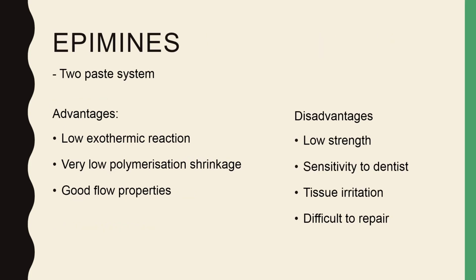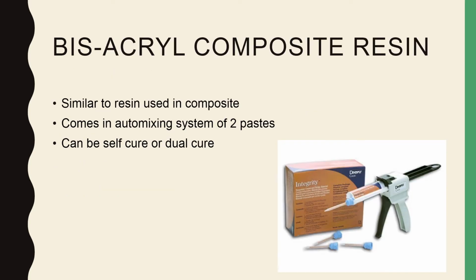The epimines are supplied in a two-paste system. They have the advantages of having low exothermic reaction, very low polymerization shrinkage, and good flow properties. While the disadvantages are having low strength, they might cause sensitivity to the dentist, having tissue irritation, and difficult to repair. They are not very commonly used nowadays.